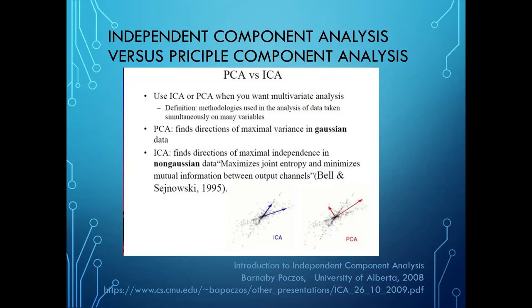If you're using EEG lab, MATLAB as a technique instead of WinEEG, obviously you've got all of the ICA techniques available as different modules within the shareware. And I do appreciate the fact that the EEG lab people have freed up their software so that people who want to embed the EEG lab modules into their own software can end up doing that. And you see that now some people within the field of neurofeedback have implemented EEG lab, MATLAB approaches to EEG processing and ERP processing within their software. And it's nice to have high level academically developed software modules that are being used commonly across the field.